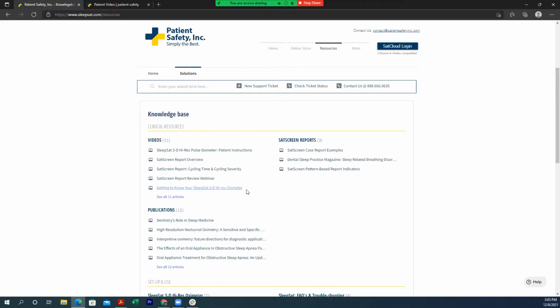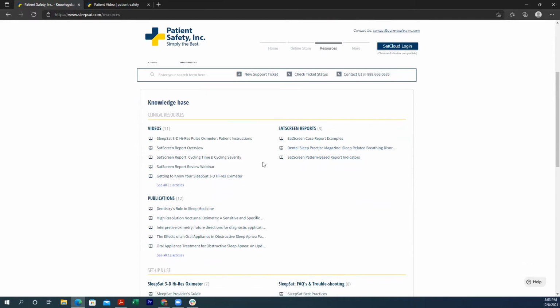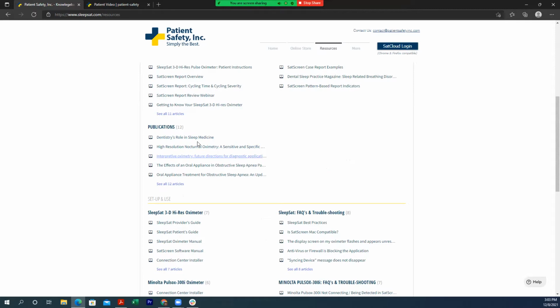So moving on from our video series, again, we've got some links there that could be just easier for you to find what you need. But we also have some documentation on the reports as well, which when you combine it with the videos, you can get a really good idea of how to read the reports and how to effectively use them to screen and titrate your patients. Next, we have all of the publications that can be found here that we've either assisted with or we've been highlighted in.